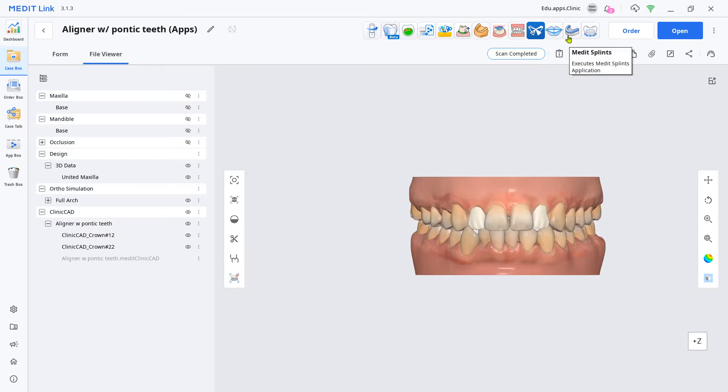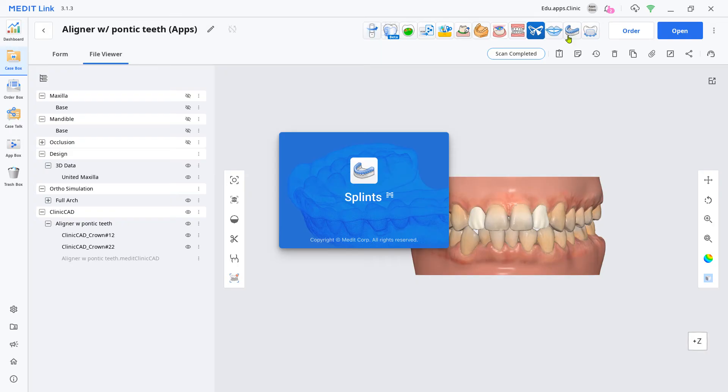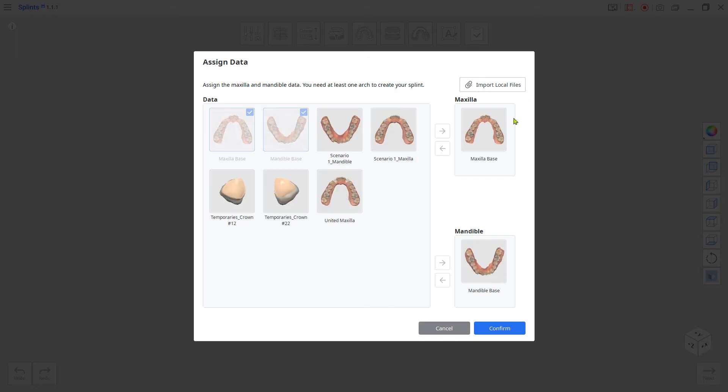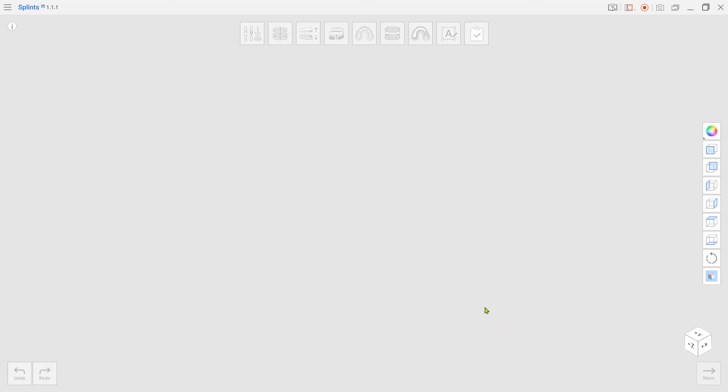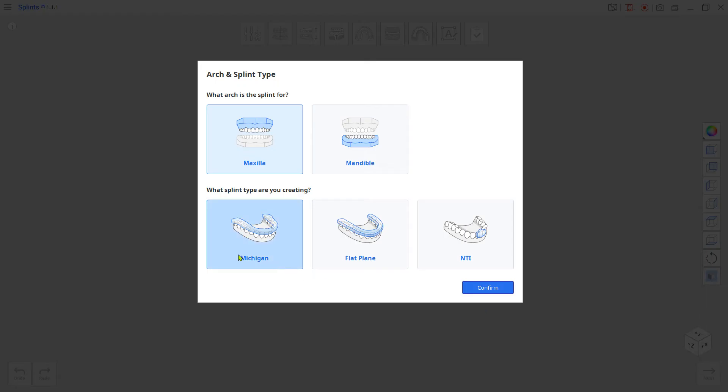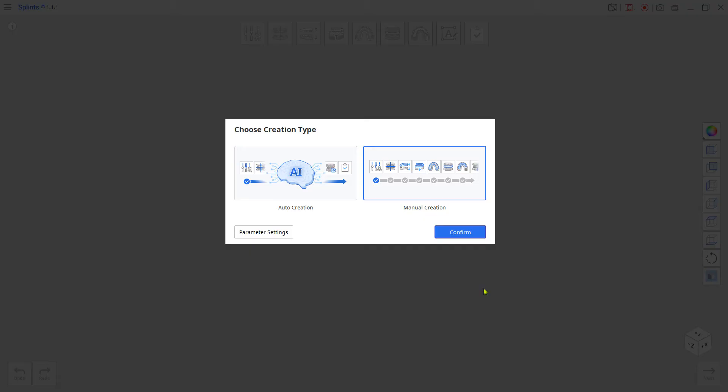Load the splints app. Swap the assigned original maxilla scan to the united maxilla. Choose the arch and choose Michigan splint. Go to manual creation.